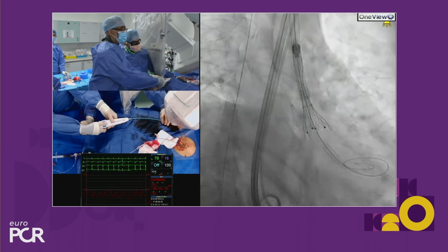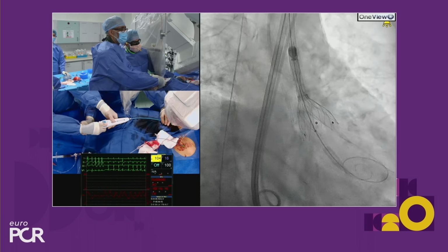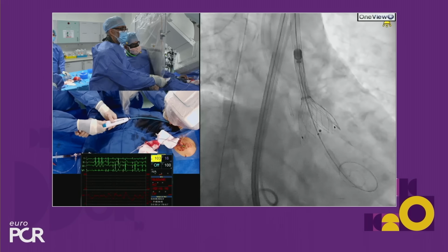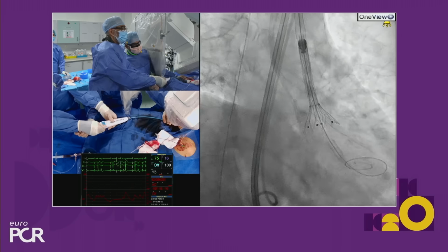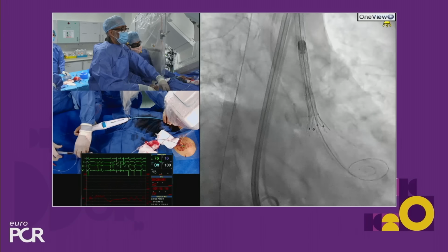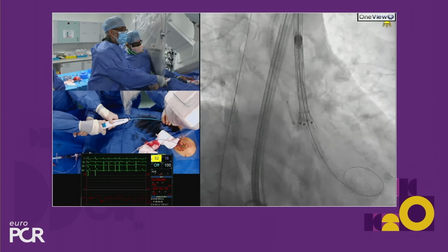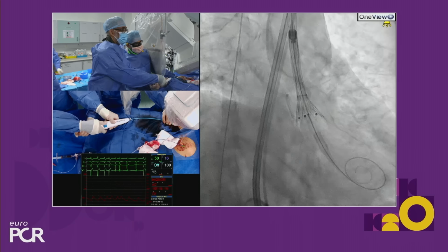Is that drifted a bit? And the pressure's down a bit. I'm just continuing to deploy. Has that gone down? Yeah, that's gone down a lot. I think we should just recapture that. We're not going to pull with that, so just hold still. So I'm just going to recapture. We won't do a full recapture. We'll just get it to around about there, and then take a quick puff of dye. I'll push on the one. Yeah, so you've done a slightly higher position, which is great. And I think that should lock it. Oh, that's looking much better.